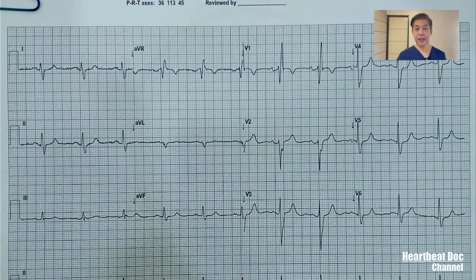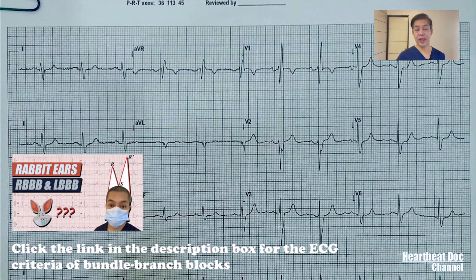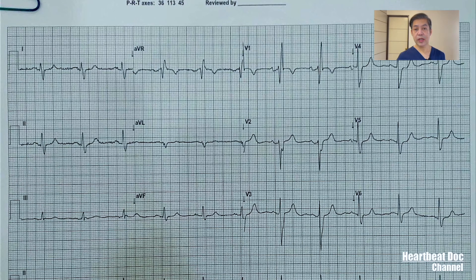The third computer interpretation is the presence of an intraventricular conduction delay. Re-examining the QRS duration, the measurement is more than 120 milliseconds or 0.12 seconds, which supports the presence of an IVCD. But looking closely, you can see a rabbit ear appearance or notching in lead V1. There is an R', and if you look at V6, the S wave is slurred and deeper. These changes support the presence of a complete right bundle branch block.